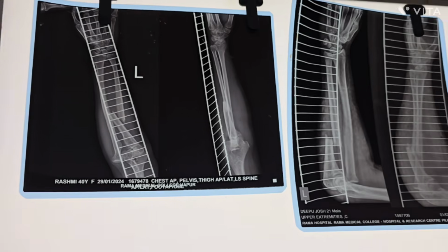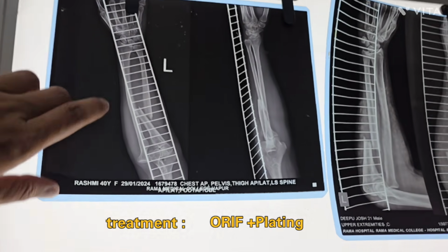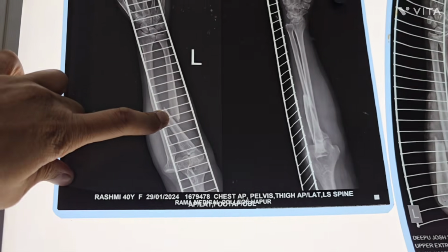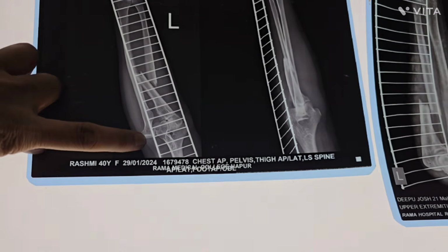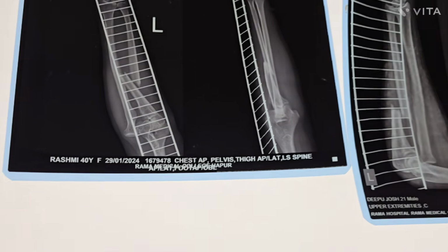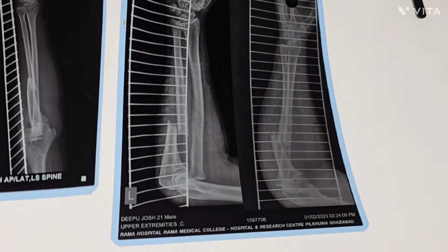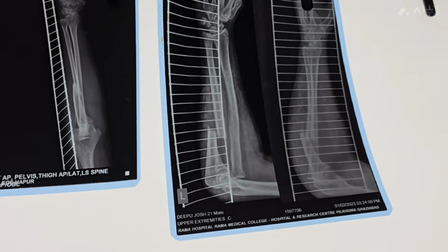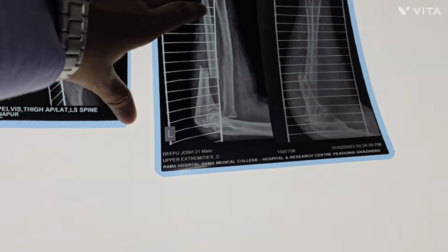Okay. So what is the treatment in this patient? Open reduction and internal fixation with plate and reduction of the radial head. So that's it. Next, another patient, where you again have to start with how to read the X-ray. Then what is the problem in this?